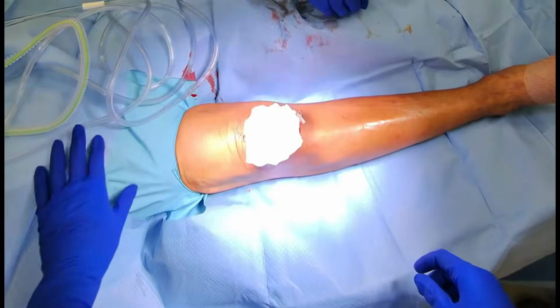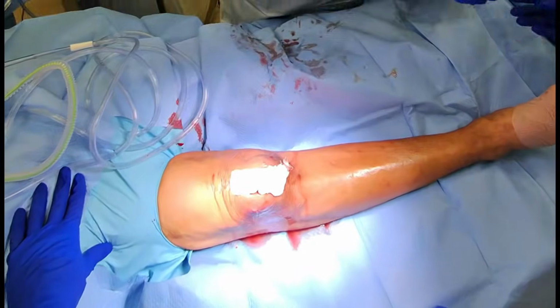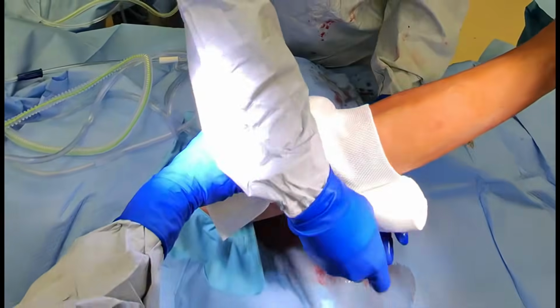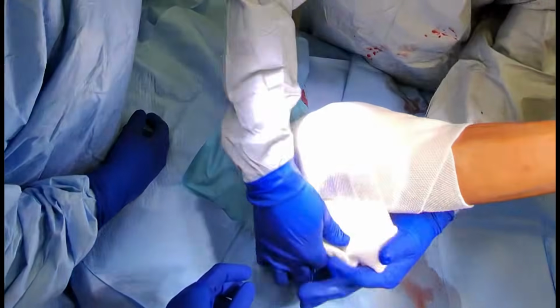After this procedure, a dedicated wound care team will continue with the management of this area. Over the course of weeks, they will, in serial fashion, remove this iodoform gauze and place new gauze into the wound. During this time, the wound continues to heal by secondary intention and the patient receives antibiotics for definitive care.